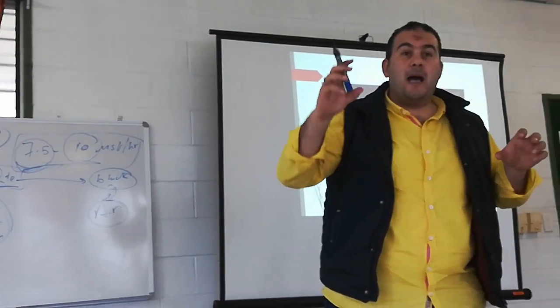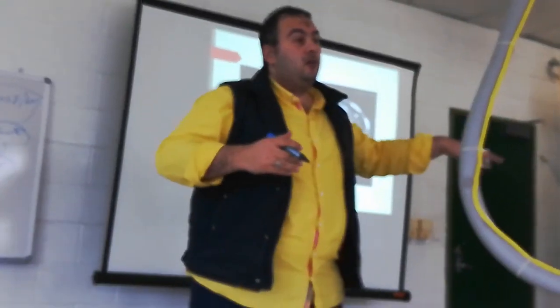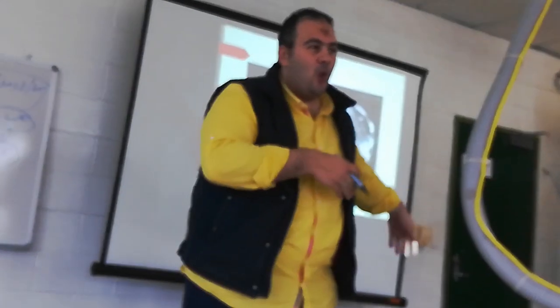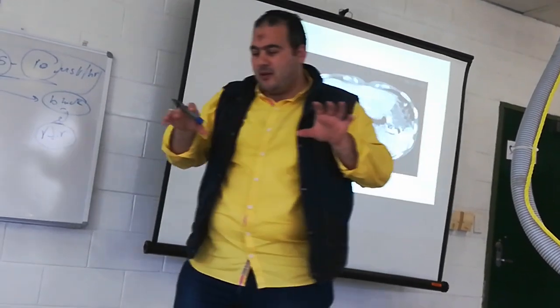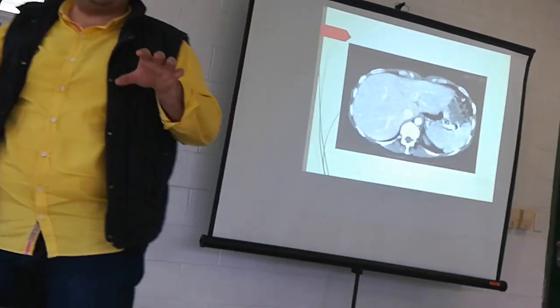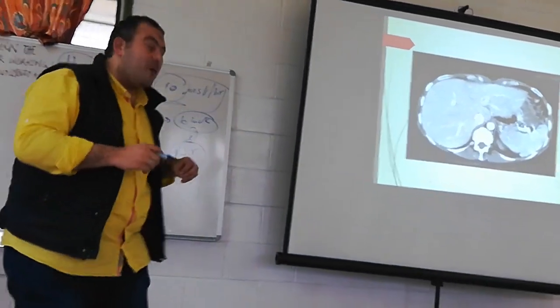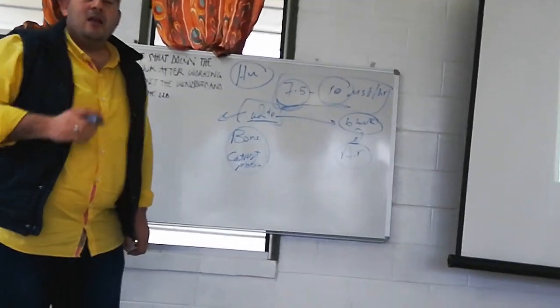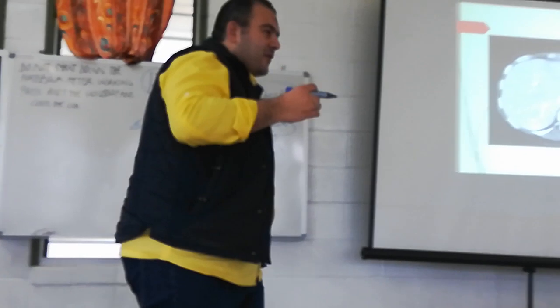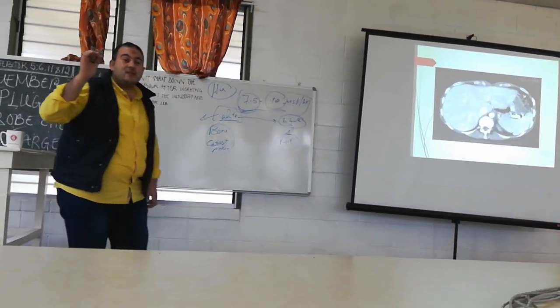So the absorption of bone to the incident radiation will be higher than other tissues like water, soft tissue, like fats. So there is a difference in attenuation of photons. This attenuation is represented by Hounsfield unit or CT number. The ideal reference for attenuation is water.